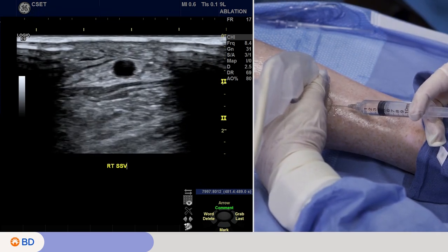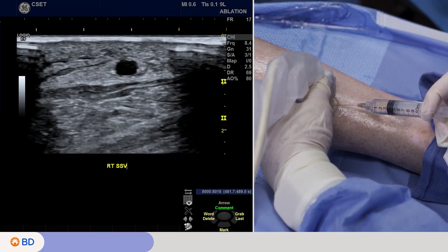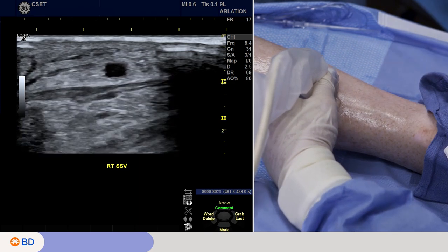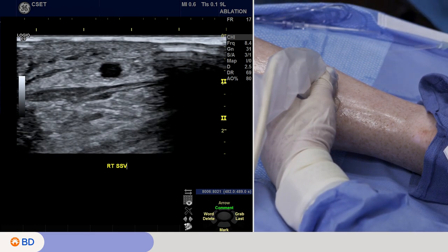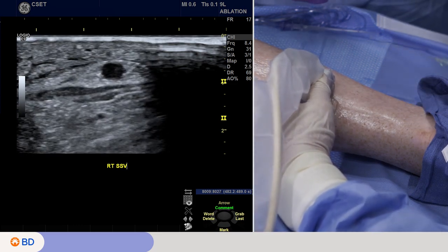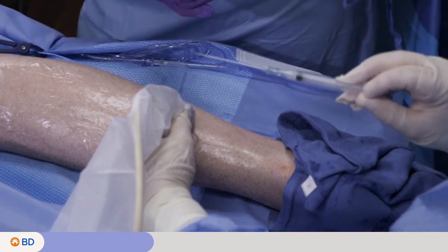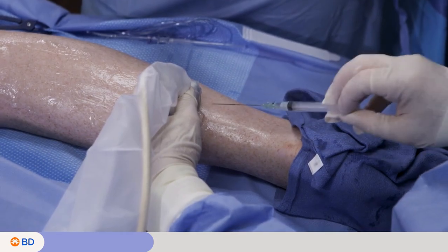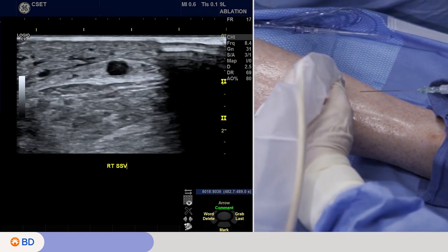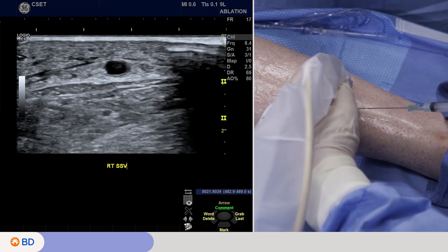I'm going to give a little wheel here — it's hard to see with the gel. You want to be careful when you're numbing the leg that you don't induce spasm right at the spot where you want to enter. I'm going pretty slow so I don't go too deep and get into the vein itself, because these veins are very vasoreactive and you can induce spasm quite readily. I have the introducer needle with the bevel up, and I want the ultrasound probe and image of the target small saphenous directly in the middle of the field, then pick right in the middle of the probe at a 45-degree angle for my approach.